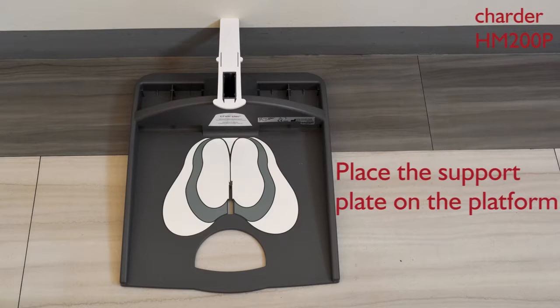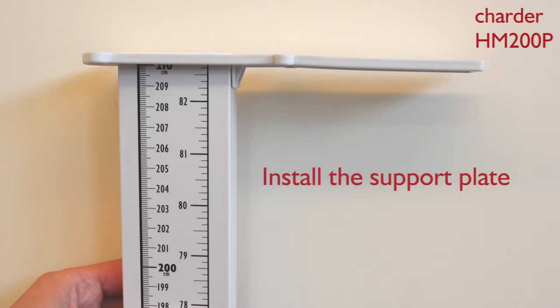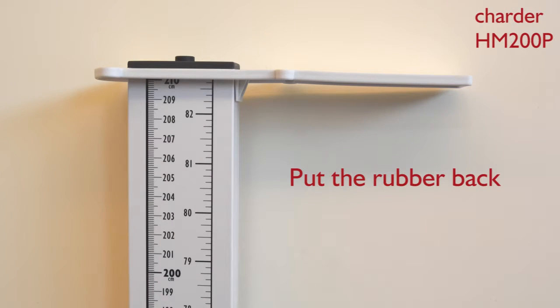Example assembly procedures: Take out the measuring rod showing 210 cm. Remove the rubber cover on top, then install the support plate on the rod. Put the rubber cover back.